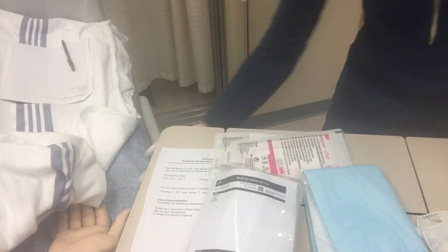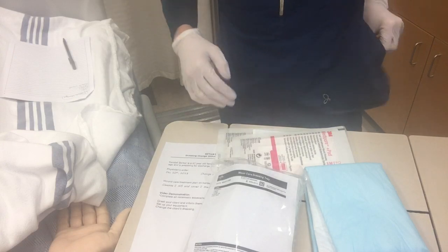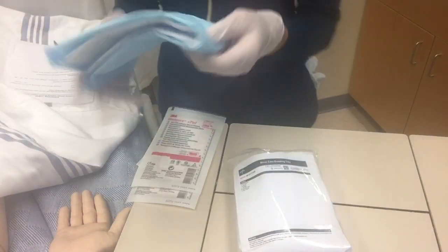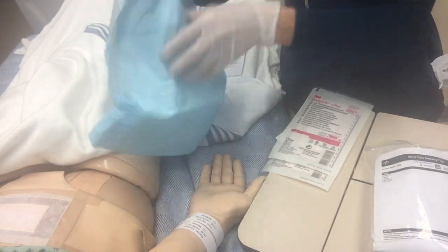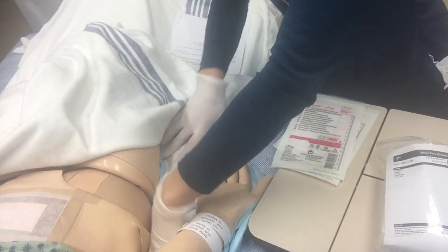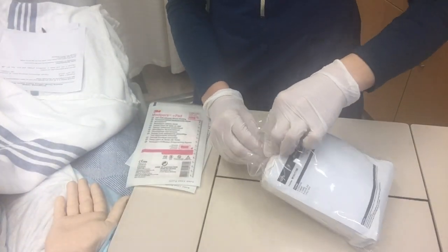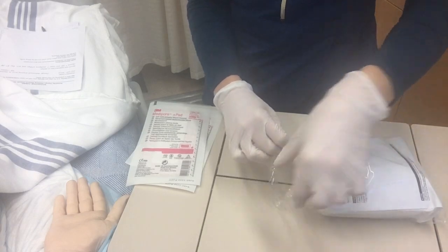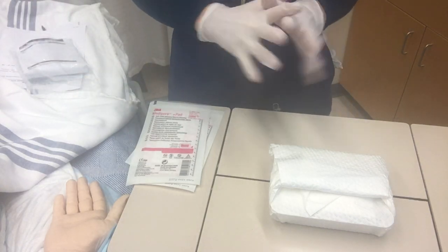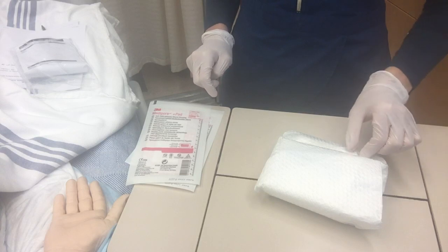So, making sure this is above my waist, which is good, and making sure I have all my supplies ready. I'm going to put this underneath, just in case I get any drips of saline. I would just be putting my gloves on now and maintaining that they're sterile. Okay, so my first tab I'm going to put away from me.